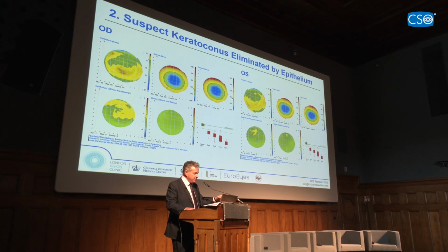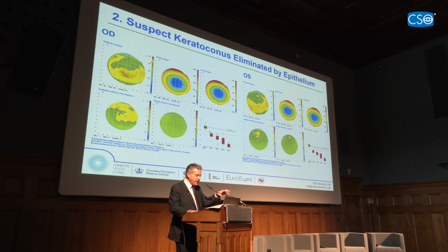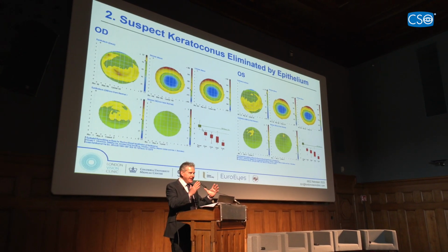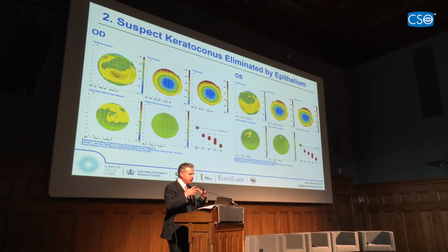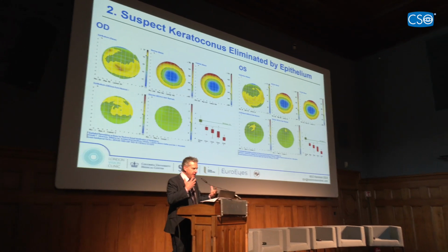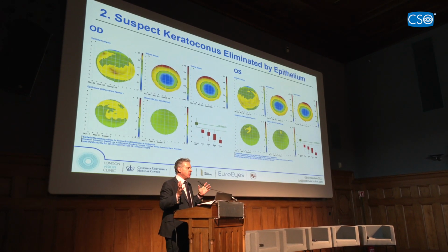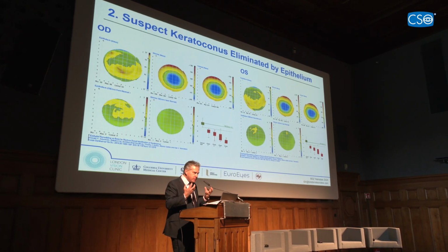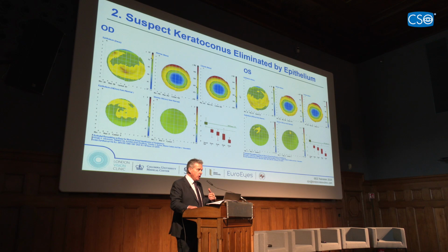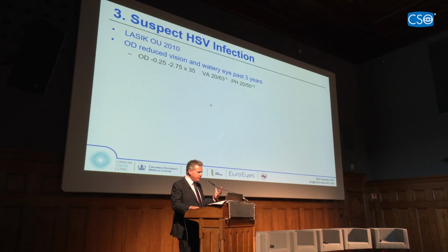On insight scanning, we have 1 micron precision on epithelium, and the CMC calculator says it is normal. So again, sometimes even an expert who's been trying to do this for 30 years is still struggling with information, and my job is to go to as many modes as possible and to develop a clinical impression for myself as to whether I think this is a high-risk case or not, and whether it's defensible if I was wrong. So those are the parameters.